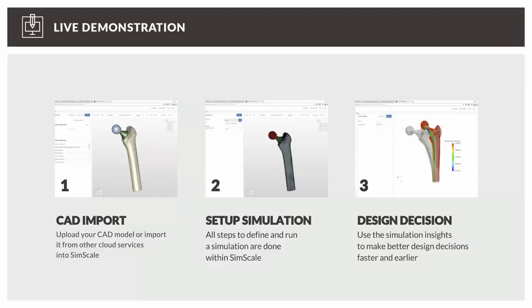Now we switch to the live demonstration. The simulation setup works in three steps. First, import and upload a clean, simplified CAD model to SimScale. Second, set up the simulation by applying materials, loads, and boundary conditions. Third — the most interesting step — look at the results to understand how the loads are affecting the hip.